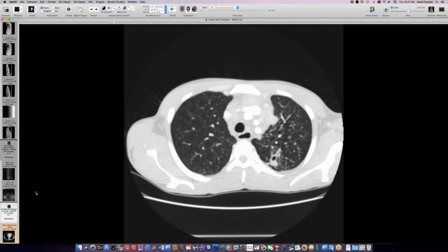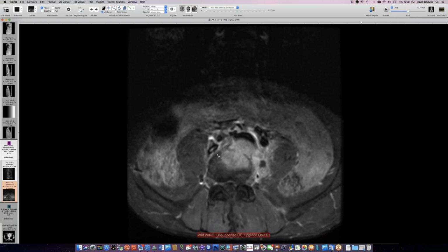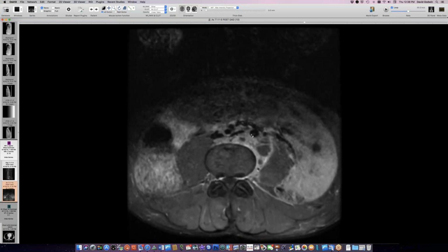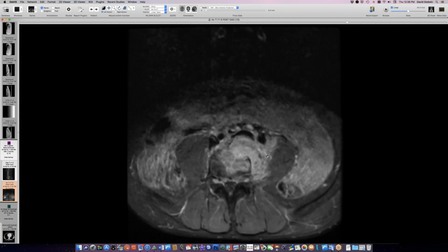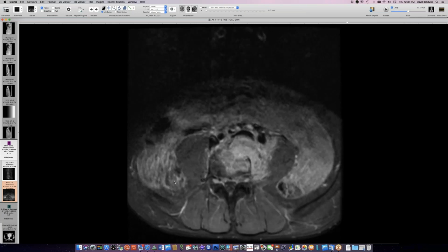He's got pericardial effusion, and a ton of lung nodules, fine nodules going everywhere, and what looks like cavitary disease up here. So here are a few images from his MR study of his spine, and you can see that he's got this paraspinal and psoas abscess down here encroaching on his spine, probably involving the bone with inflammation. This is post-gad. So tons of infection here, low attenuation lymphadenopathy, upper lobe cavitary disease. Everybody was thinking TB, and it turns out this is coccidioidomycosis. This is Coxy.